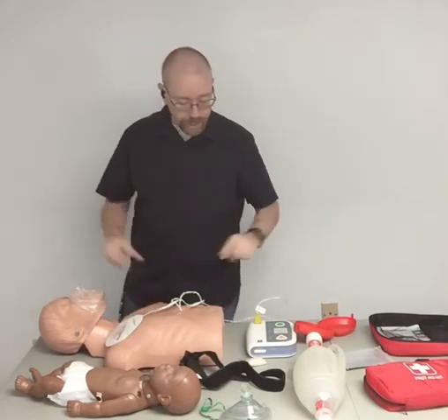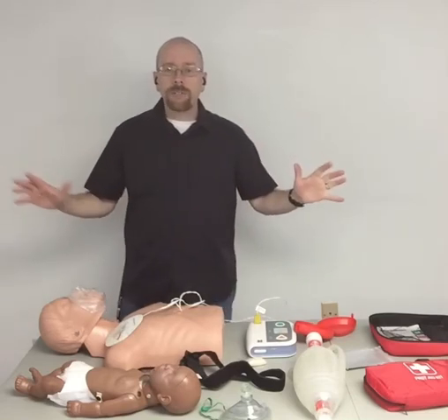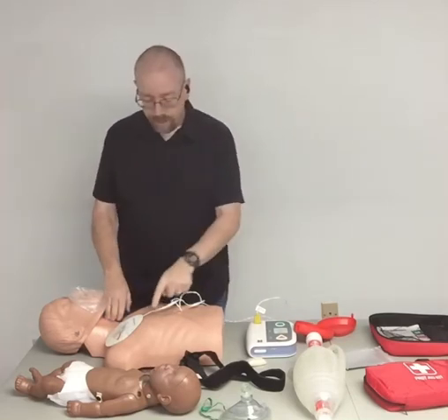Everybody stand clear. Shock now. Press the orange button on 3. 1, 2, 3. Shock delivered. It's safe to touch the patient now. No signs of life. Begin CPR. Start CPR.